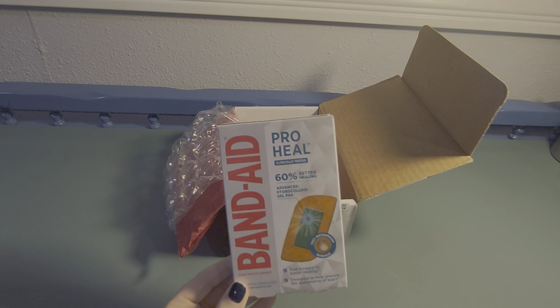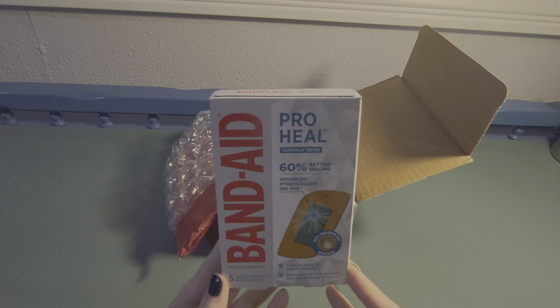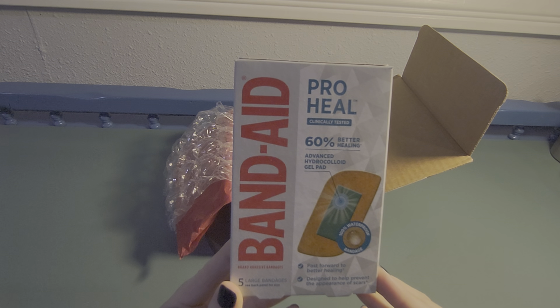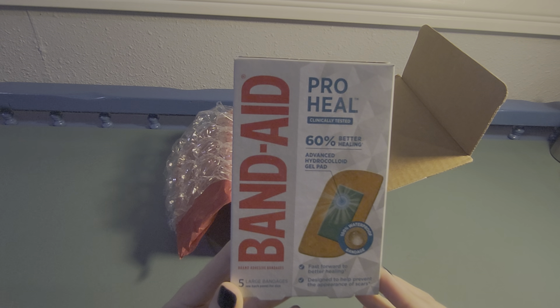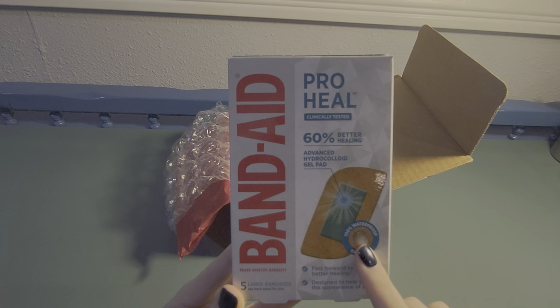Anyway, we have some Band-Aid Pro Heal clinically tested bandages. These are five large bandages. They've been clinically tested to show 60% better healing, and there's an advanced hydrocolloid gel pad.